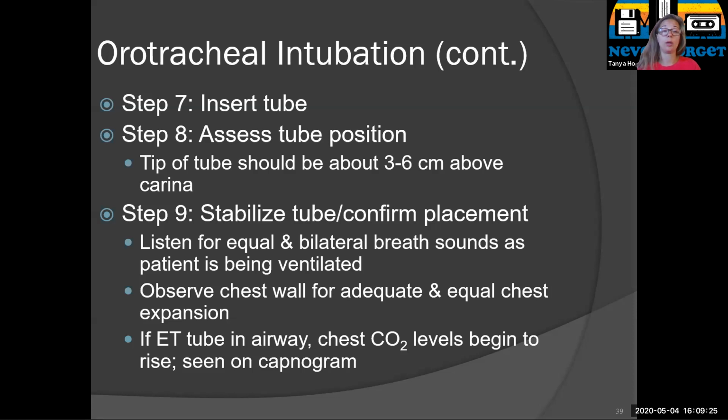So those are all signs that it's in the airway. Okay.